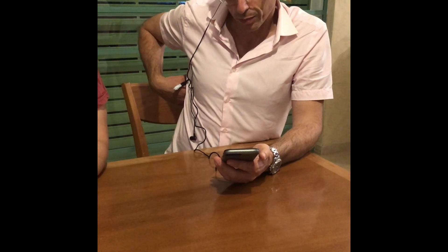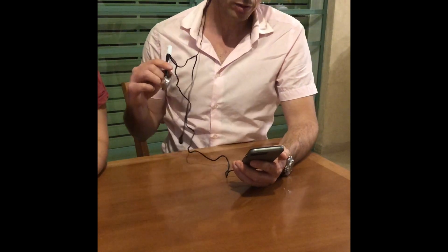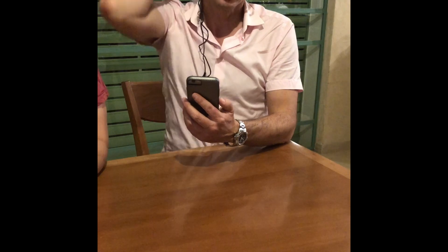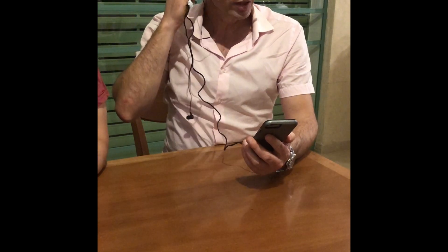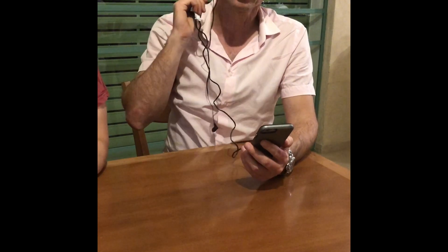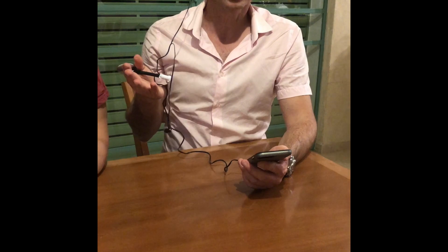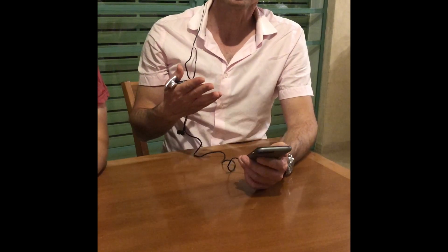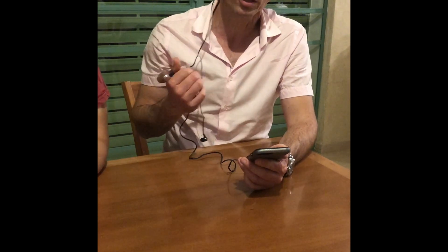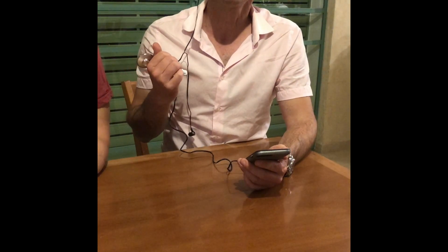If I have a problem putting the stethoscope on my back, I may need another person to help with the physical examination of the back. At that stage, that person might need to hear the doctor direct them, so they will need to put the earphone in their ear to hear the directions. Afterwards we finish the physical examination, talk to the doctor, and receive directions on medication and how to continue.